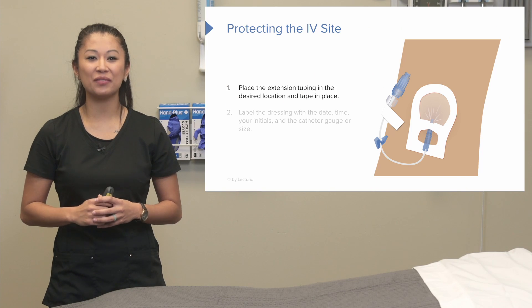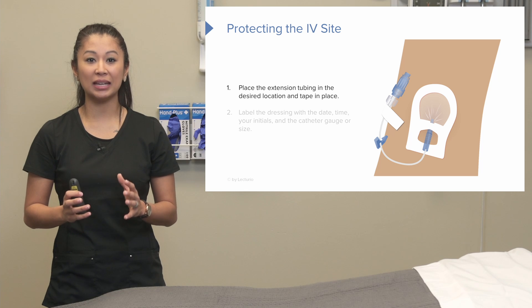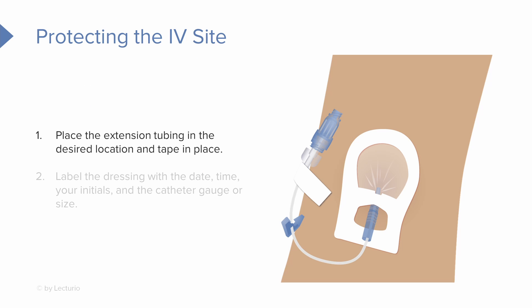Now that we've attached the extension tubing, we need to protect the IV site we just put in. Place the extension tubing in a desired location and make sure to tape it down securely in place. Then we need to label the dressing with the date, time, initials, and the catheter size that we used.